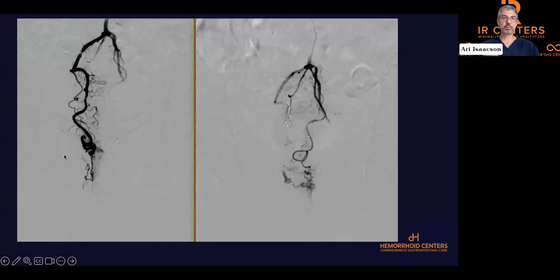So that was a little movie representing what it is. These are actual pictures from the procedure. Again, we're using moving X-ray or fluoroscopy. And we can see in this image right here, this is called the superior rectal artery. This main artery right here is supplying blood down to the hemorrhoid, which is down at the bottom. So the catheter goes down and deploys those particles, and then this coil, which you can kind of see right here. And once we do that, the blood is no longer able to pass through this artery, and you can see there's no longer this contrast dye in the blood down in the hemorrhoid area. So we basically shut off the blood supply to the hemorrhoid, which causes the hemorrhoid to shrivel up and no longer bleed.